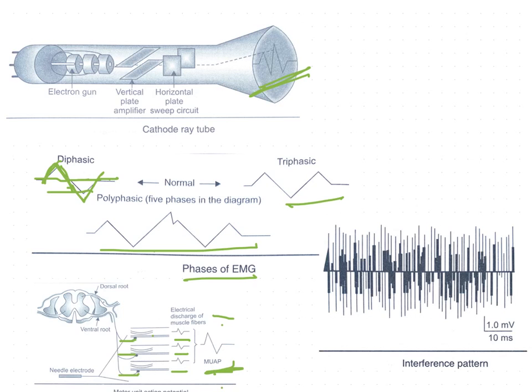An important finding is that the patient gets sharp pain as this potential appears, which disappears when the needle position is changed. Nerve potentials represent discharge from very small nerve branches which are penetrated by the needle electrode.